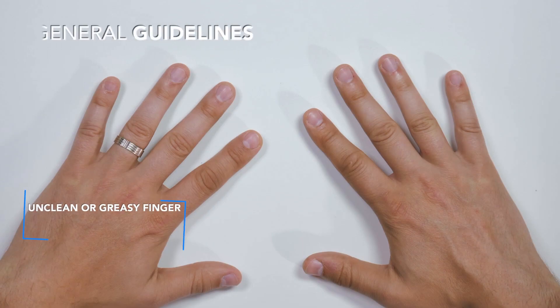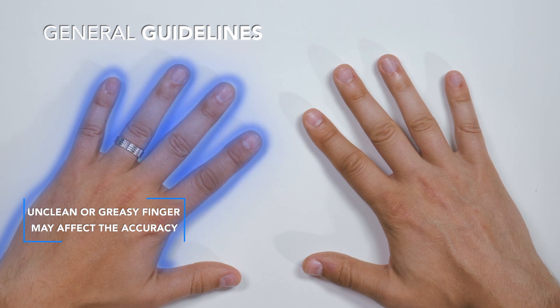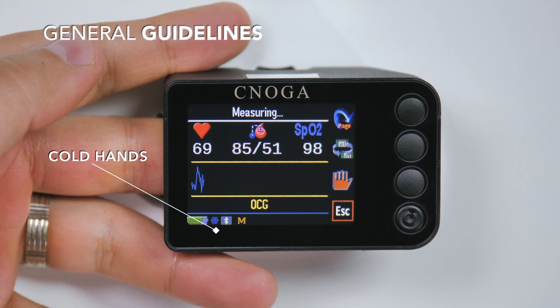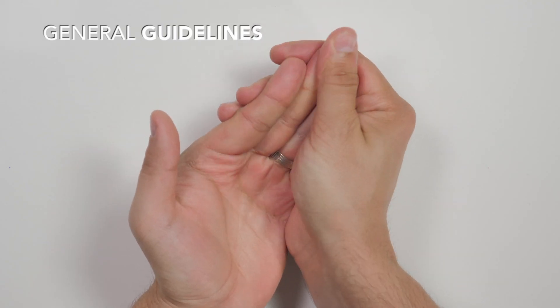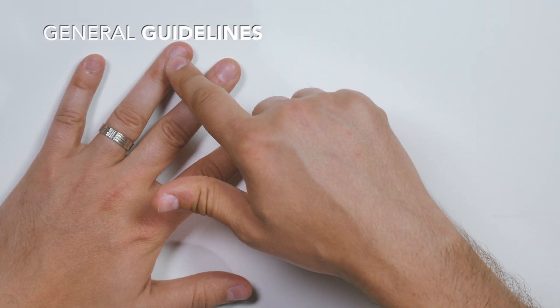Make sure that the fingernail is clipped and your finger skin is intact and not cold. If a snowflake icon appears, warm your hands by gently massaging your finger or rinse in warm water. For the measurement, use the middle or the ring finger of your left hand.